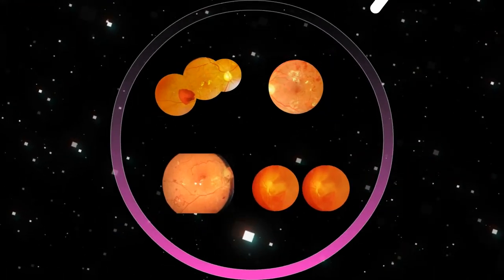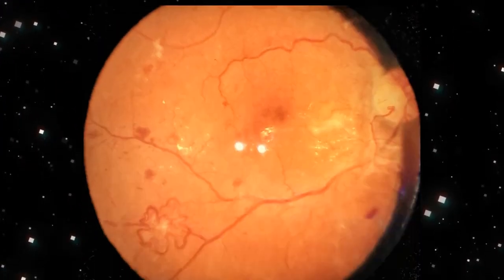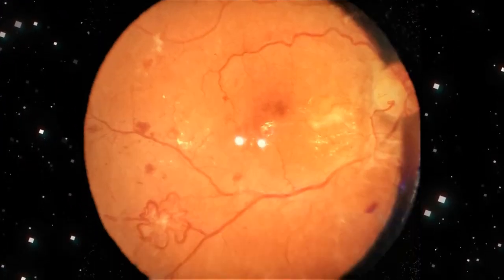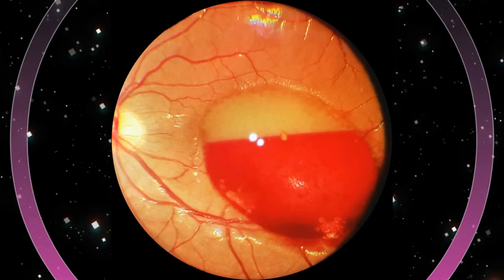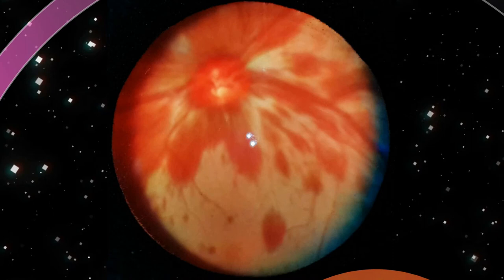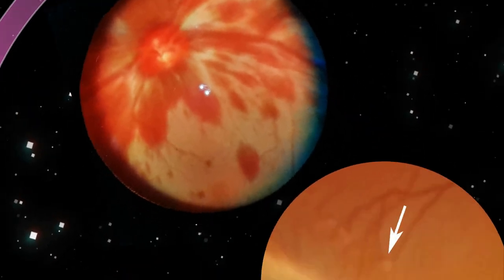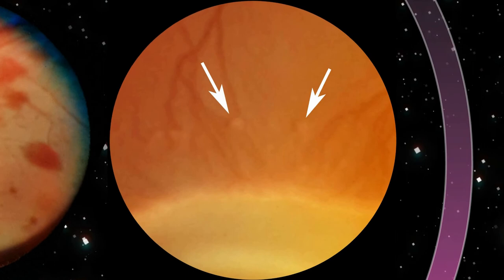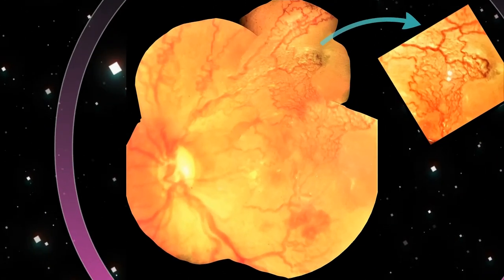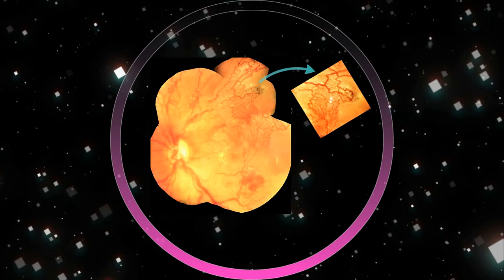Excellent images can be captured with this technique. It's a handy device that is portable and can be used for imaging paediatric cases as well as in screening for retinopathy of prematurity. Here is an image of a neonate with multiple retinal hemorrhages secondary to thrombocytopenia. This neonate has stage 2 retinopathy of prematurity with popcorn lesion, and this is a montage of a neonate with aggressive posterior retinopathy of prematurity.